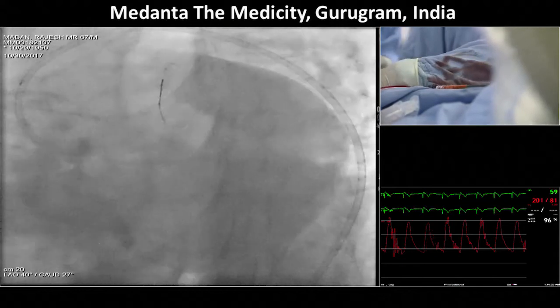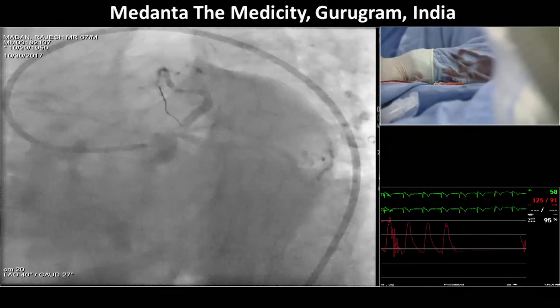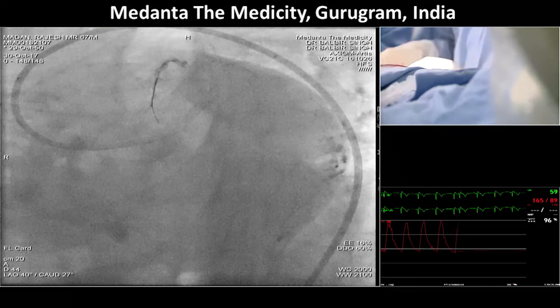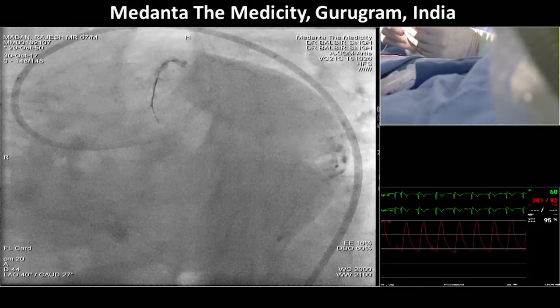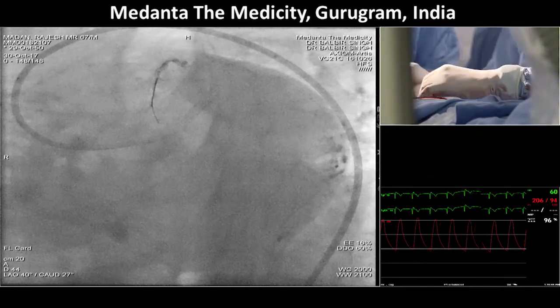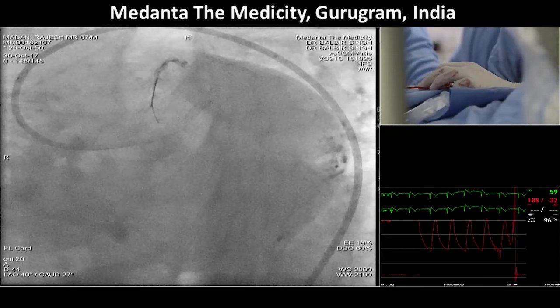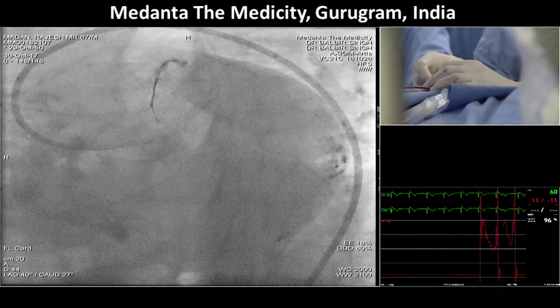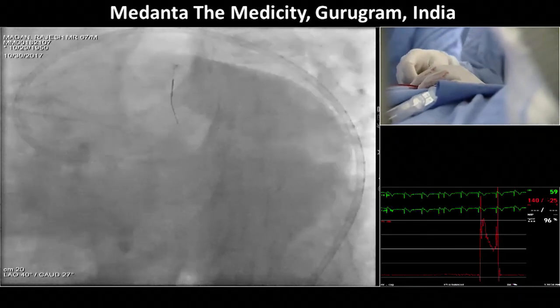Regarding the guide catheter for left main stenting, I would ask the panel, is there any personal favorite guide catheter for doing this intervention? Dr. Santoso? I normally like to use extra backup catheter, just like this. Myself, the same. I think I'll ask the operator to use whatever they're comfortable with. I personally just use extra backup for most cases because sometimes you never know what you need.